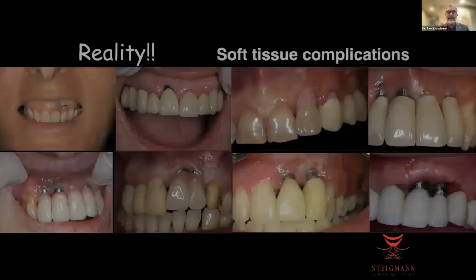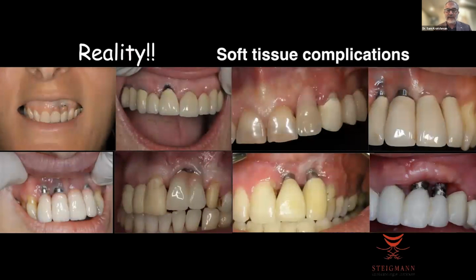So my friend Marius, because he is such a well-known prosthodontist in Germany, gets these cases. These are those bottom drawer cases where you can see pink acrylic here. You can see part of the implant showing. You can see these cases which are scary, right?